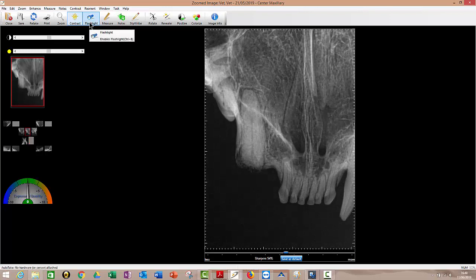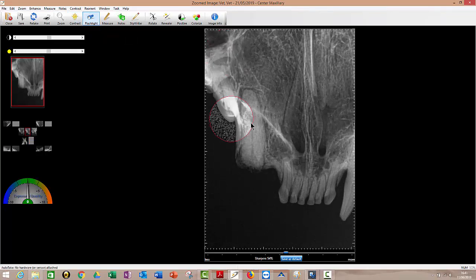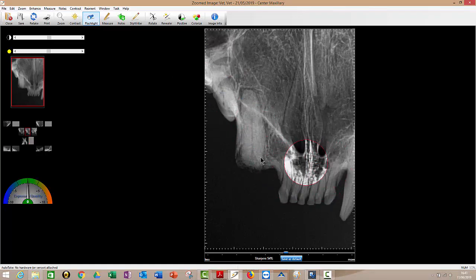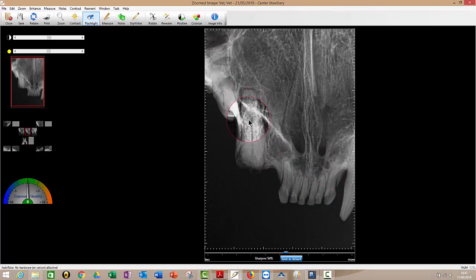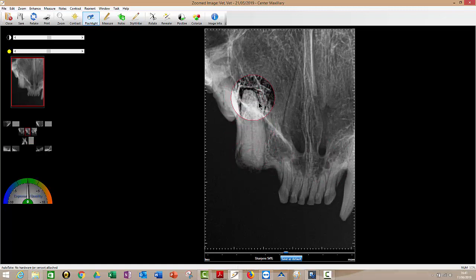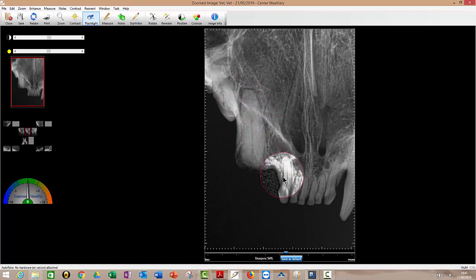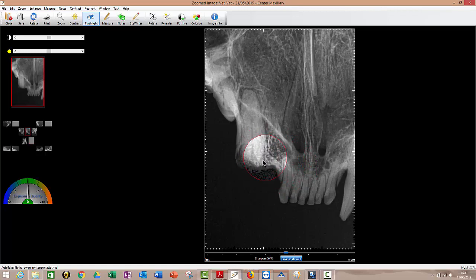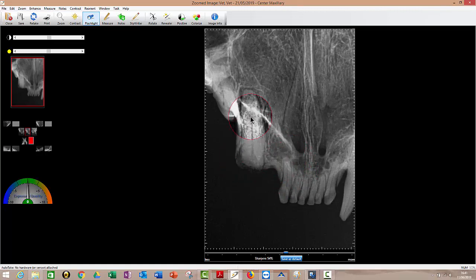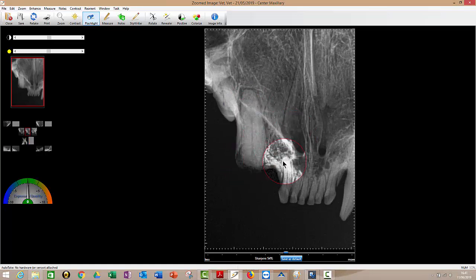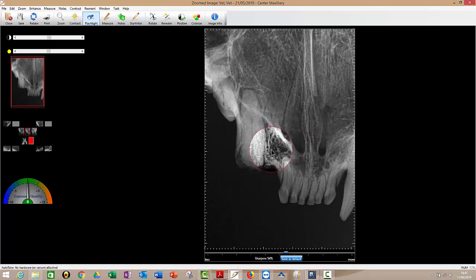Flashlight is a useful one. If I click on that, bring my cursor over here, you see it kind of sharpens up the edges. So it's like holding a flashlight over so you can see the root canal going down there. You can see the periodontal ligament slightly fuzzy on this image because this is a skull. So it tends to desiccate a bit, but you get the idea. This retained root here, you can see there's still what looks like a live nerve going through there. So if this was an actual case rather than the skull, you'd probably be needing to extract that.